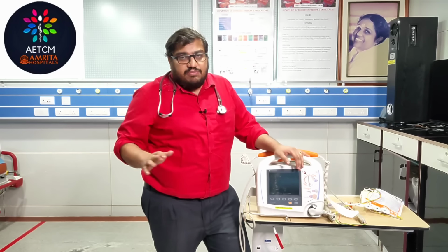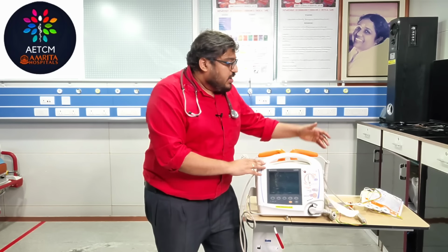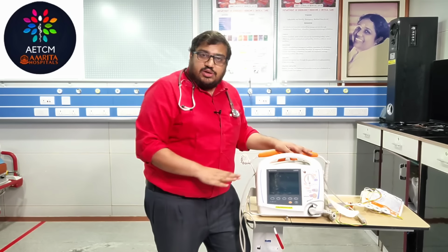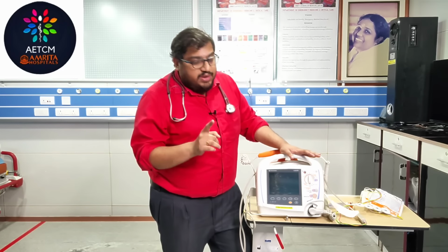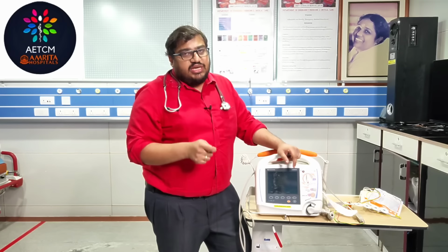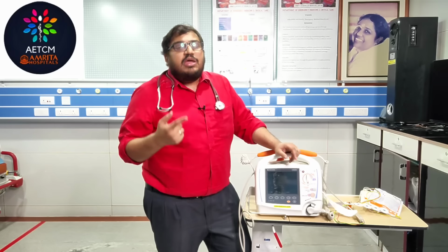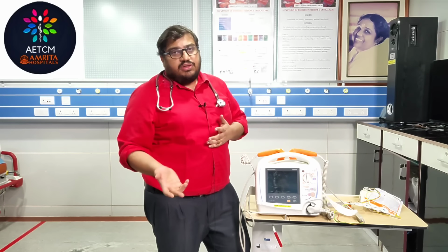Cardioversion, the procedure is the same. We have said we have to get consent. The parts, everything is the same. You can use either adhesive paddles or the routine paddles, and you need to deliver the shock. But remember that you need to switch on the sync button and keep the paddles for at least another 2 seconds, so that the machine will recognize the rhythm and deliver the shock. And depending upon what happened after the shock, you can decide on further treatment.